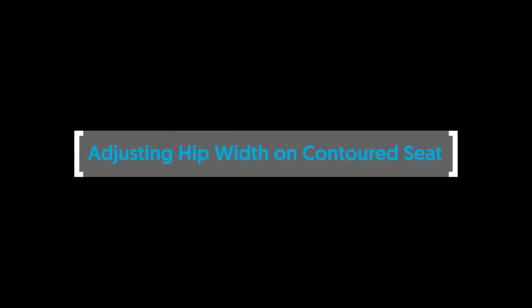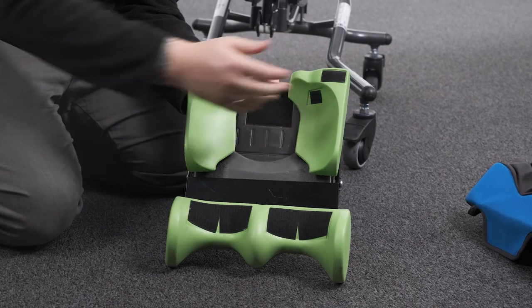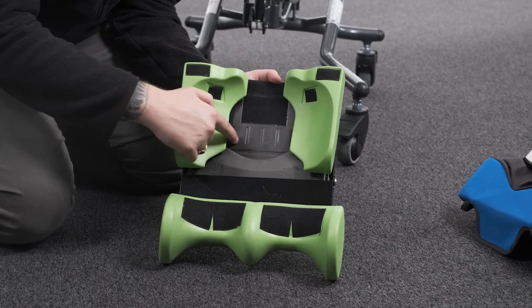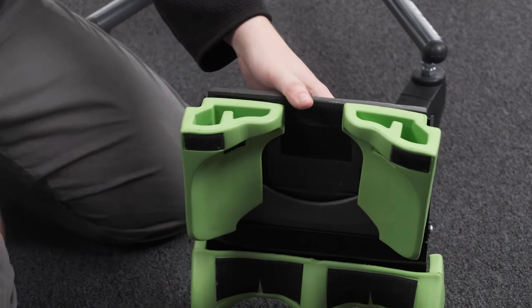Adjusting hip width on the contoured seat. To adjust the hip width on the contoured seat, the left and right hip pads can be repositioned on the velcro base where the short dashed lines aid positioning and alignment. Align the back edge of the pads with the back edge of the platework.